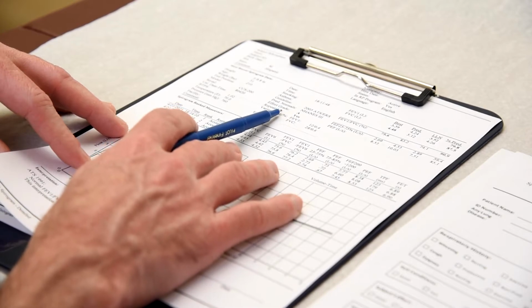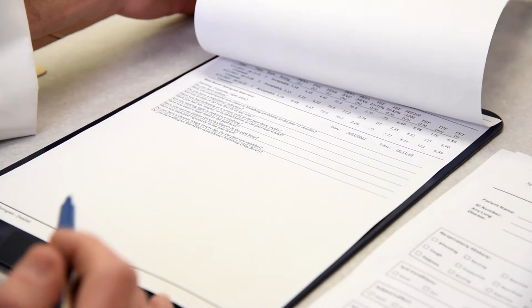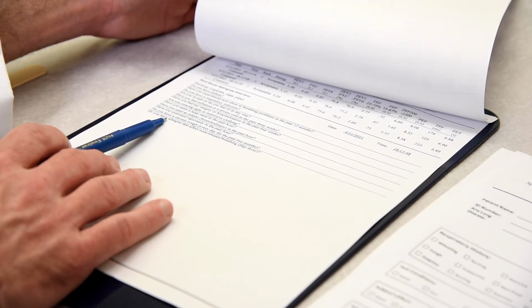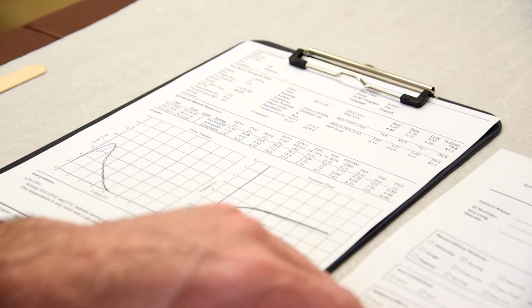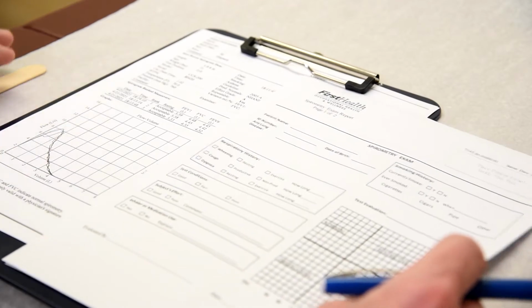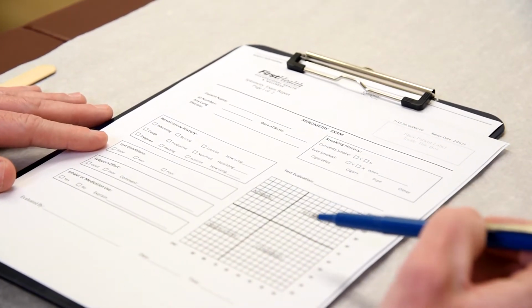You can see the effort, you can see the repeatability, and also if you flip over, the questions can be answered as well on the computer when they're performing the test. So all of this information can be completed at once and you won't have to double document. However, knowing that you don't have a full understanding of the interpretation and not everyone's NIOSH certified, this is an easy graph to give your interpretation.